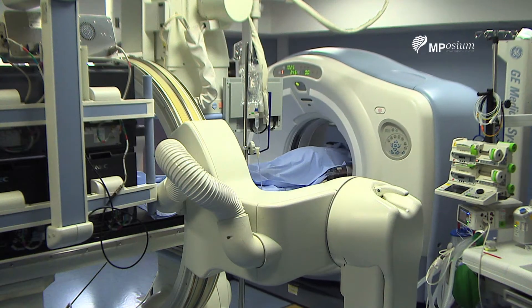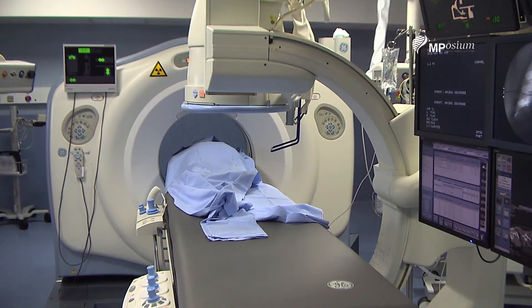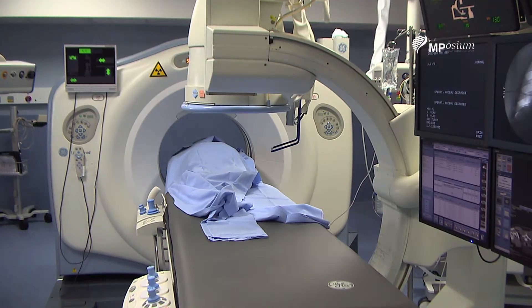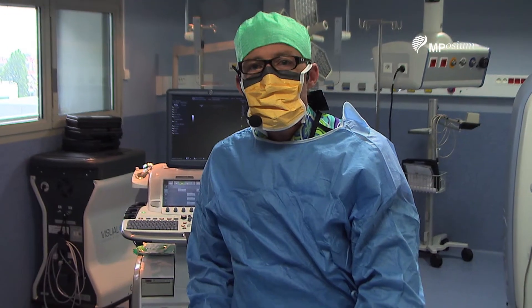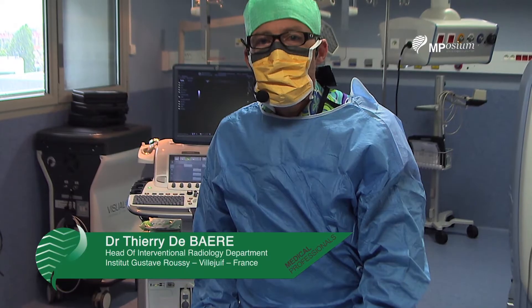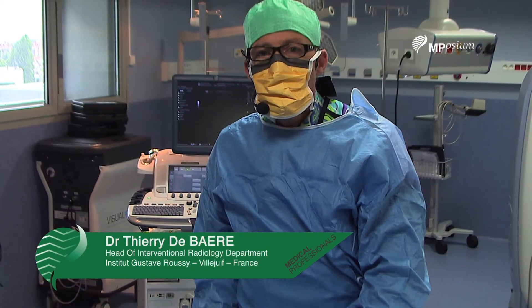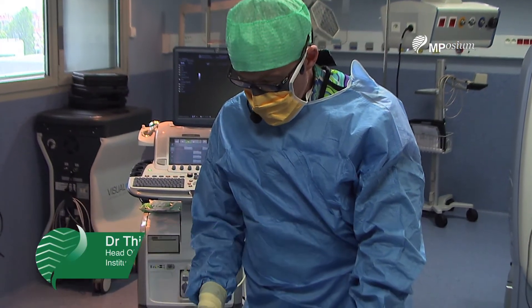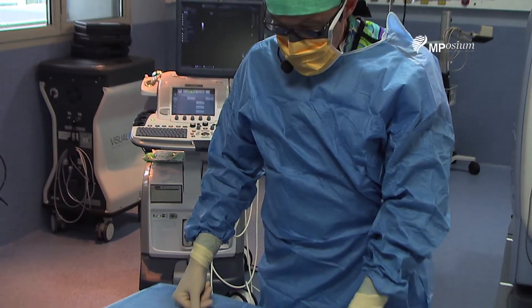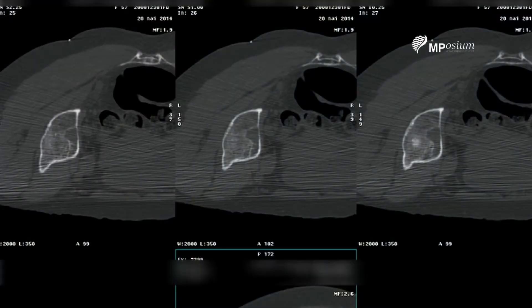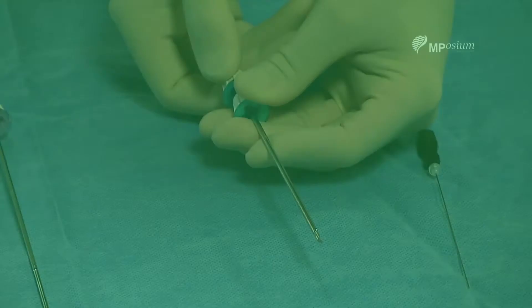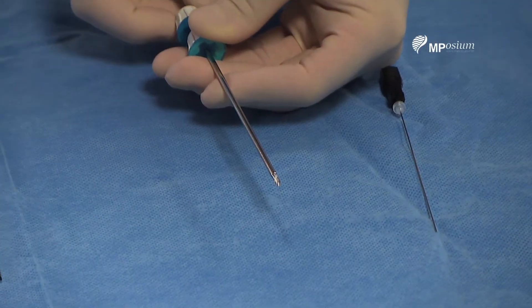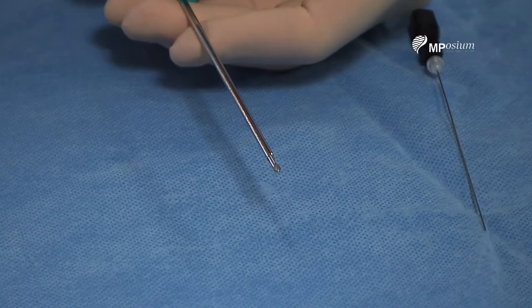I will perform a bone biopsy under CT guidance, and I will target pelvic lytic lesions. As you can see, the lesion is about 10 cm deep from the skin using this needle.